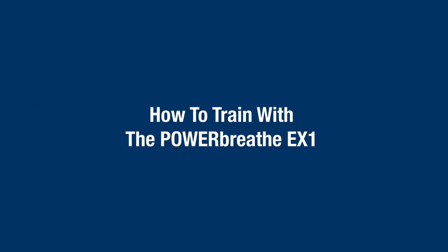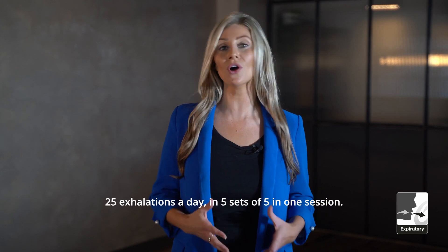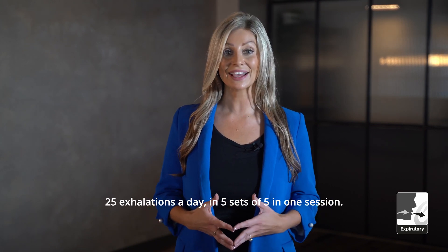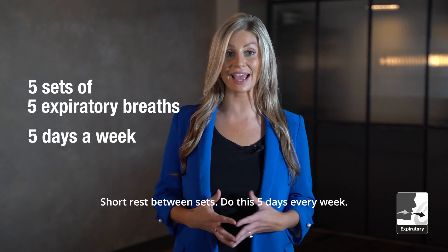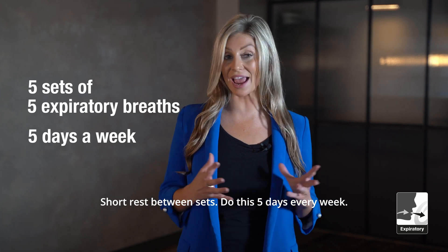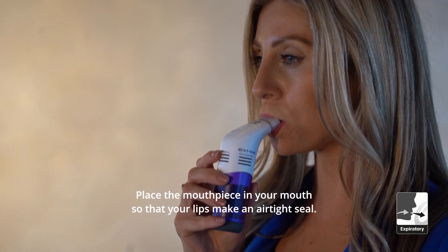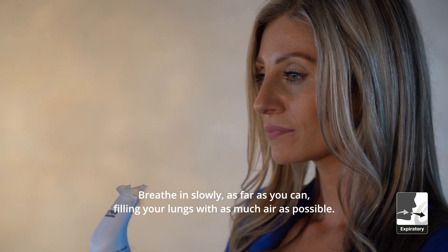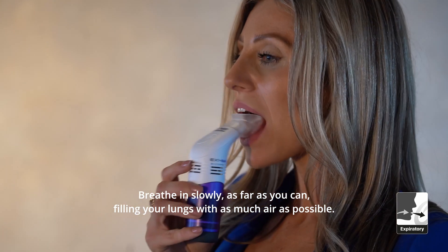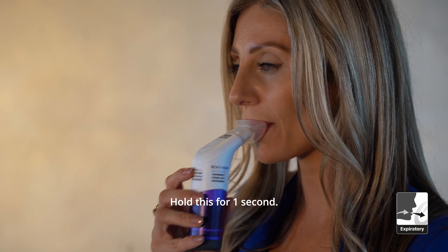How to train with the PowerBreathe EX1. During your training session, you are aiming to complete 25 exhalations a day in five sets of five in one session, with a short rest between sets. Do this five days every week. Place the mouthpiece in your mouth so that your lips make an airtight seal. Breathe in slowly, as far as you can, filling your lungs with as much air as possible. There is no resistance when you breathe in. Hold this for one second.